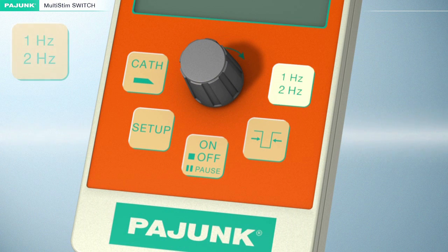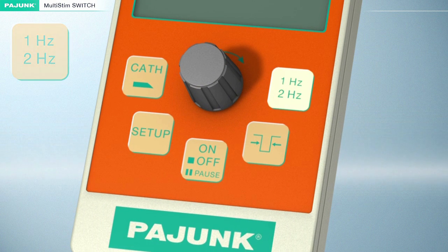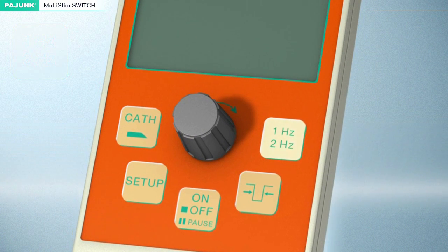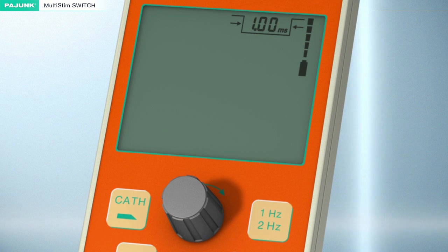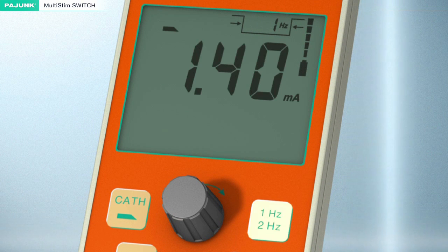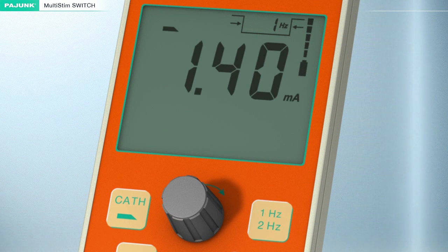Pulse Repetition Frequency. The desired pulse repetition frequency can be selected with this button: one hertz or two hertz.